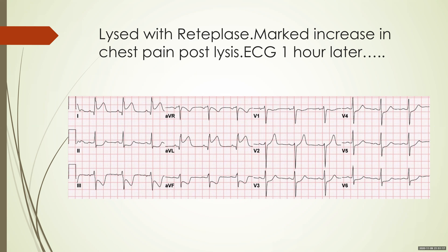This ECG shows ST elevation in leads 1 and aVL with reciprocal changes in leads 2, 3, and aVF. The ST elevations in the inferior leads have completely disappeared and are replaced by ST elevations in the lateral leads — so this is now a lateral wall MI.